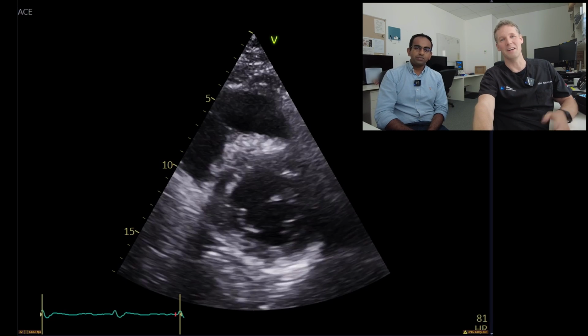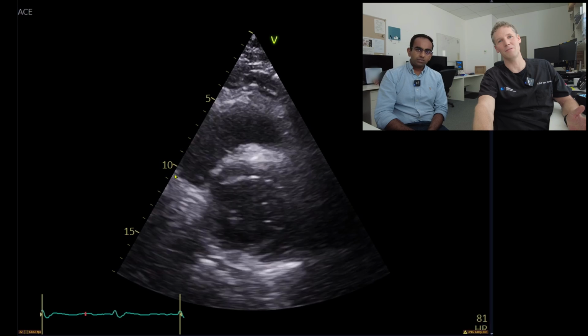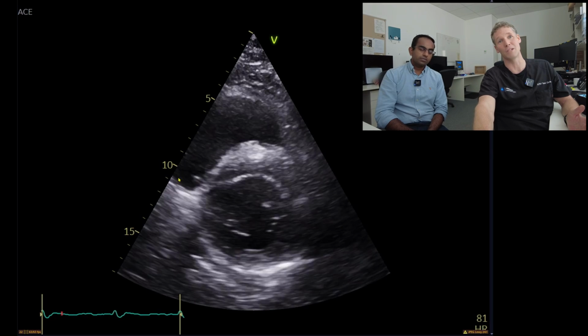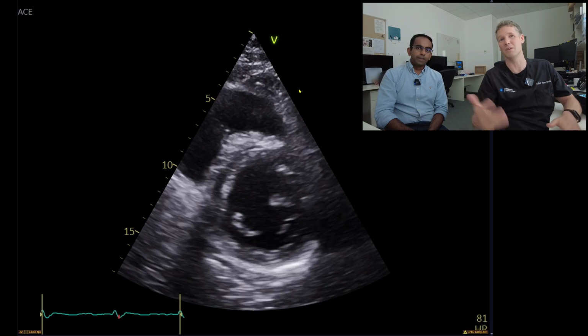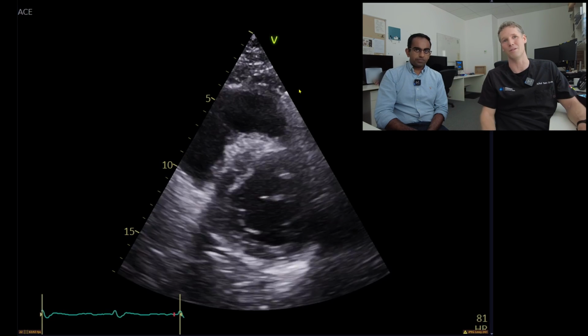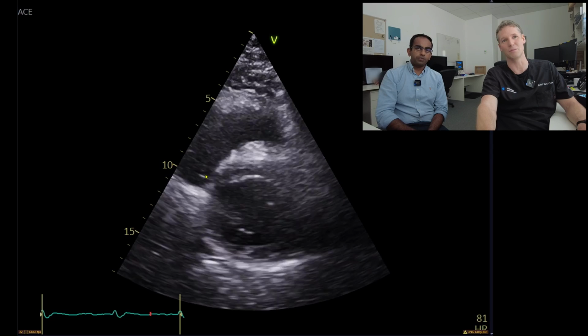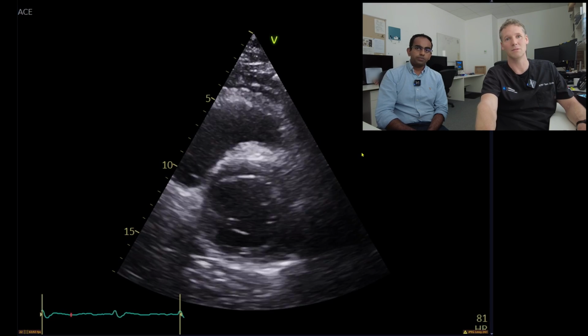I know it's not often talked about, but can I persuade you that the inferior portion of that right ventricle is also not moving as much as the anterior. We don't talk about regional wall motion abnormalities a lot in the right ventricle. But you can understand why this guy would be hypotensive, because half of the ventricle, we can't see it brilliantly, but it's not working very well.